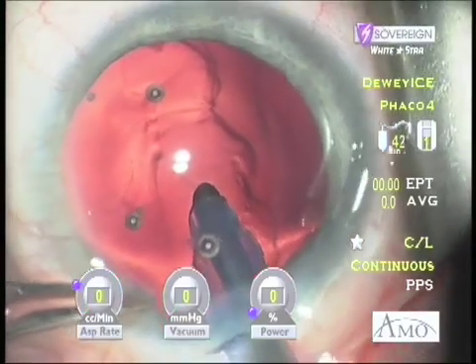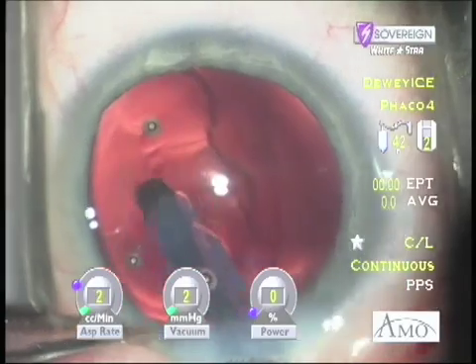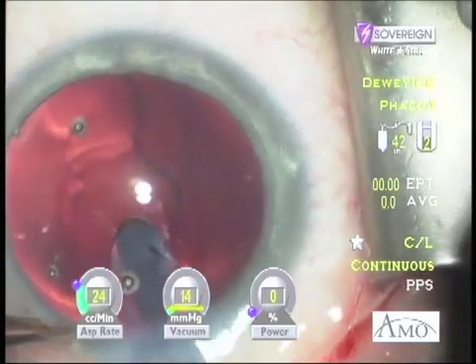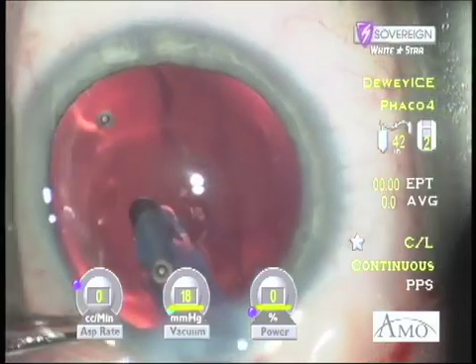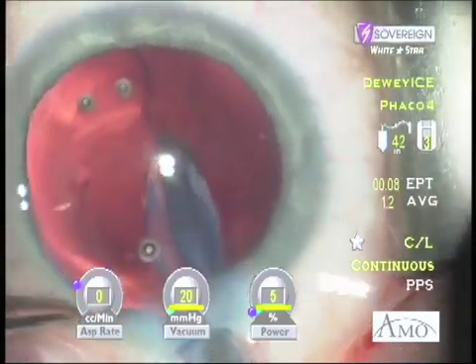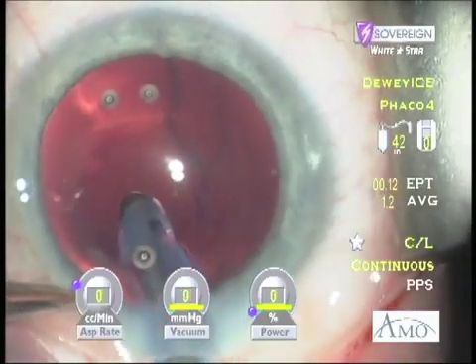In this example, I start with simple vacuum and do see some material removed as visualized in the red reflex. As I continue the process, overlapping the polishing strokes, I stop seeing progress and then begin to depress the foot pedal into position 3, applying power. The capsule plaque separates from the capsule, and this capsule is nearly pristine with the application of only 12 one-hundredths of a second of estimated FACO time.